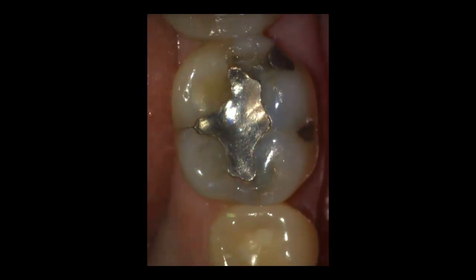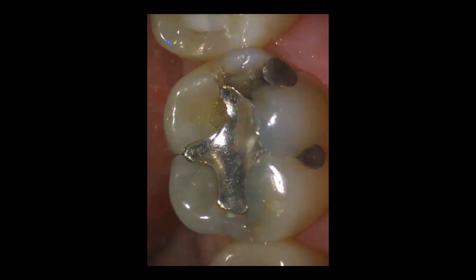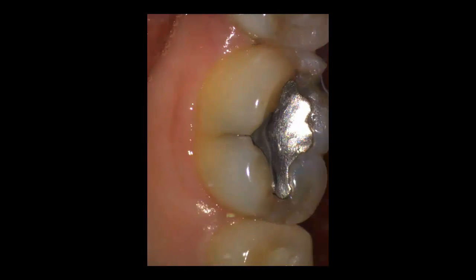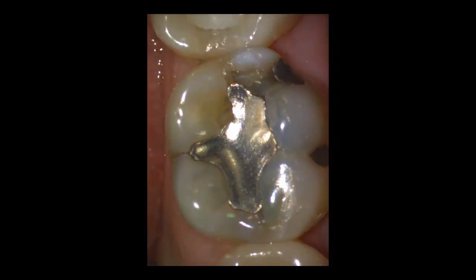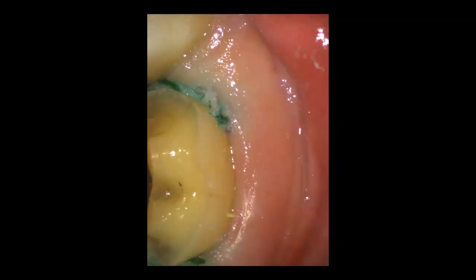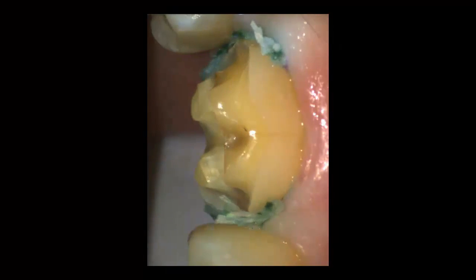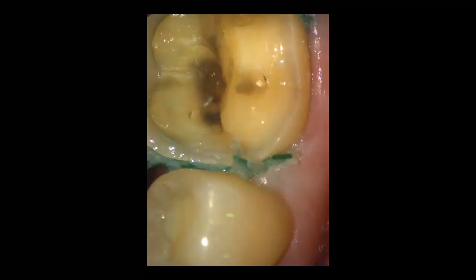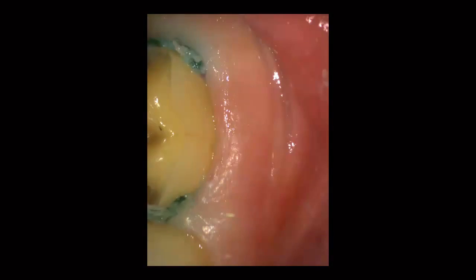This particular tooth — you saw the final picture to start with. This is where we started and it's got some issues. It's got some cracks on the distal, out the lingual, but there's some pretty good lingual structure there and actually some pretty good structure on the buccal. I'm going to show you the preparation I did. I call this a crown lay. I came down the buccal to pick up that alloy that was on the buccal. On the lingual, I tried to take out that crack down a ways, but still maintained a little bit of protection there.